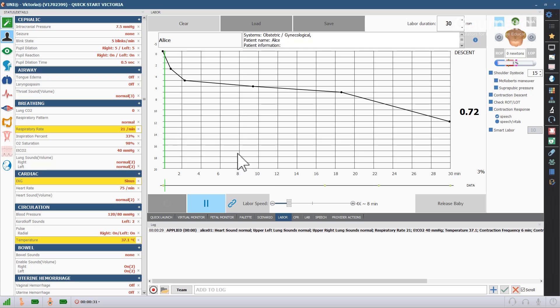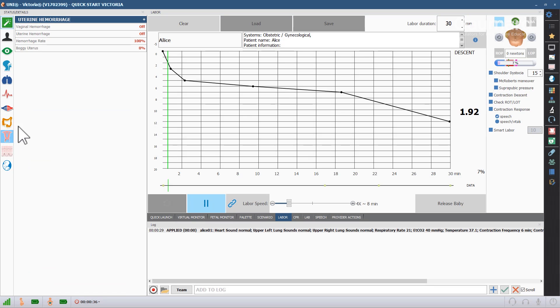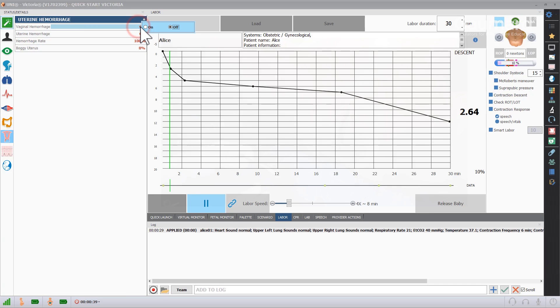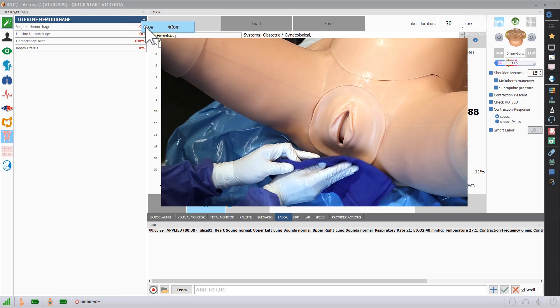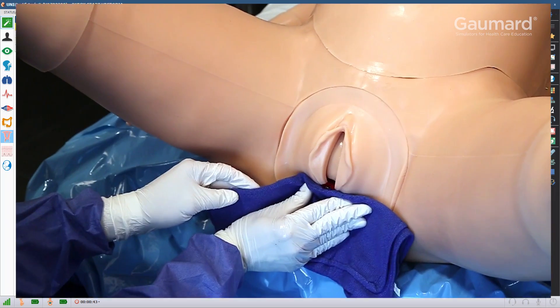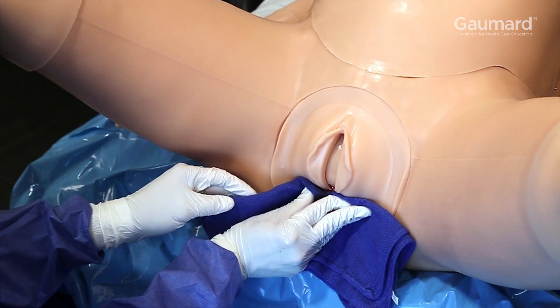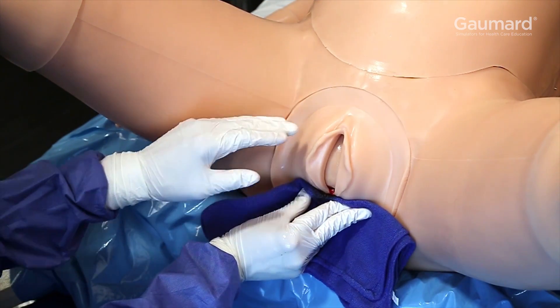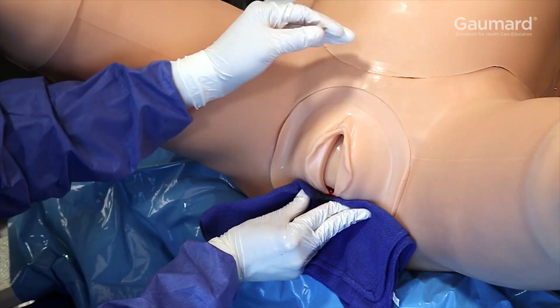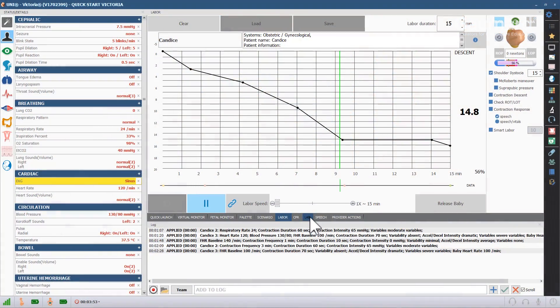To activate vaginal bleeding, click the icon of the uterus in the submenu on the left. Click vaginal hemorrhage and click on. When the baby reaches the appropriate descent, if vaginal hemorrhaging is turned on, the simulator will bleed. The bleeding will stop automatically, or you can manually turn it off by clicking the vaginal hemorrhage button and clicking off.